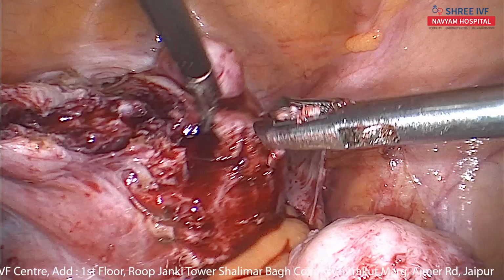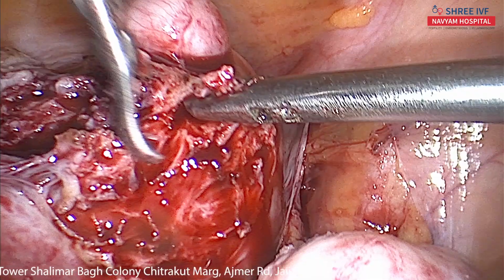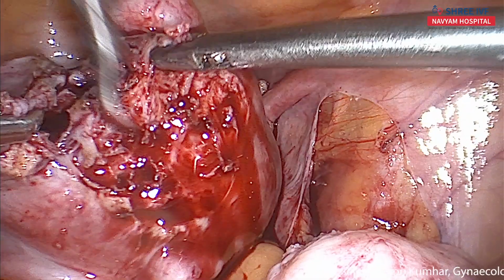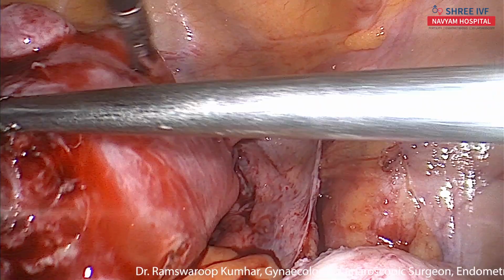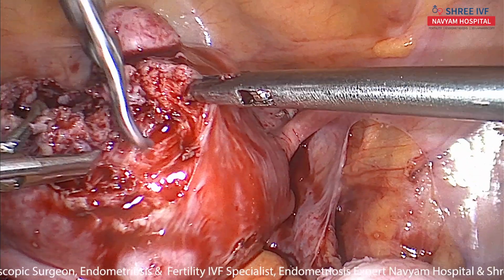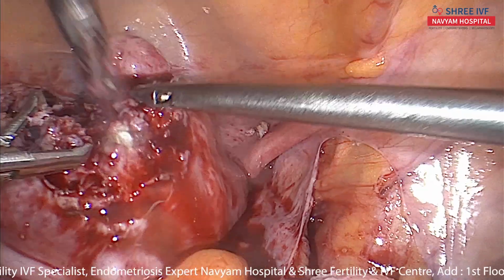Now, this is another myoma here. I think there is no myoma. This is the deeper myomas. Hold it. These are two deeper myomas.